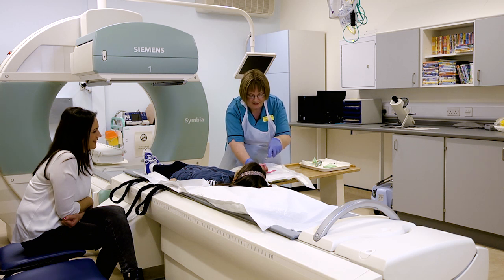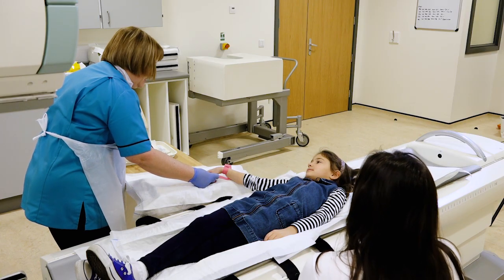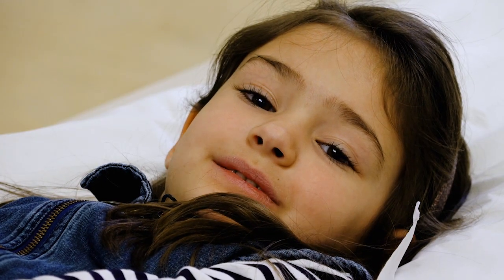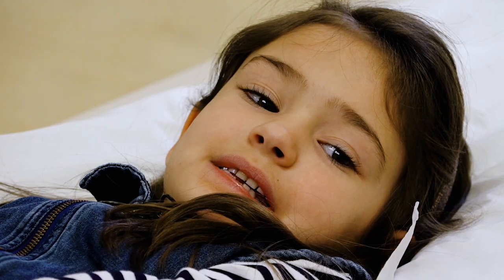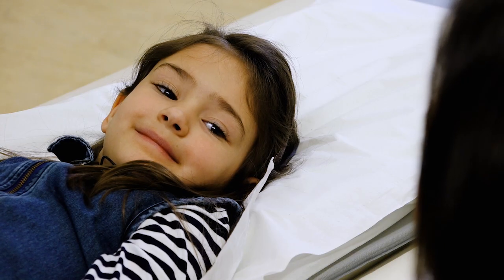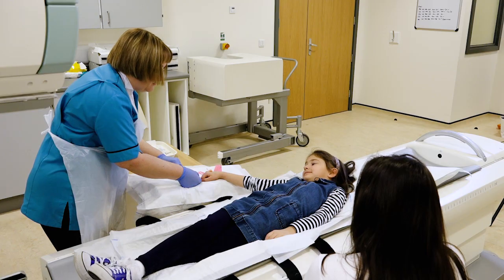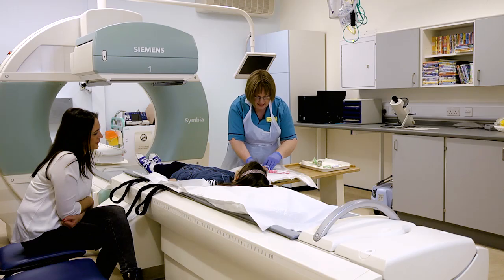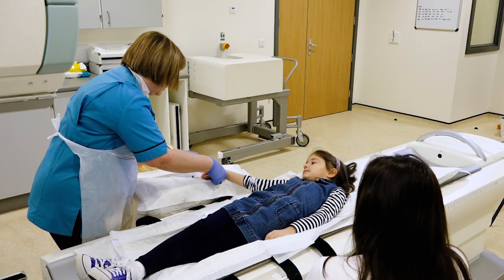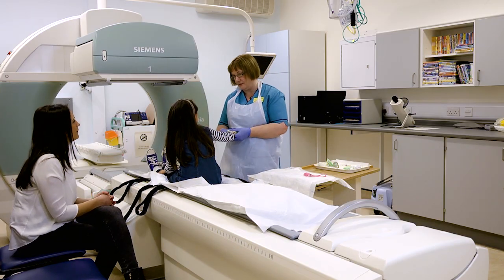Is that very very cold? Okay, nice and still. If you look at mum and have a wee chat, we're just going to do the injection — a wee sharp scratch. Oh, well done, clever girl. Just take this tight band off now and pop your hand there, and we'll give you your magic medicine now. You're doing very well. We're just going to slide this needle out of your hand. Well done you. Just hold your hand for a few minutes.